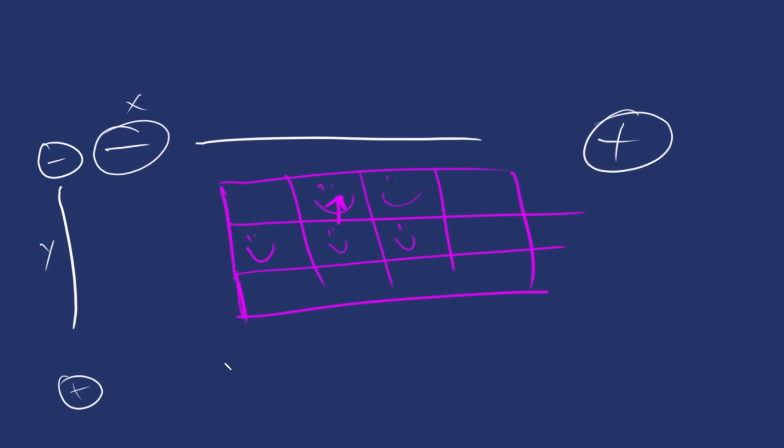Now, whenever these are picked up on the EKG, they're being picked up as a vector. Okay. So if we were to say that this guy went off with a force of 2, just for the sake of explaining this part, because when you get more in depth, it can make things kind of confusing. Let's say he had a force of 2 going this way. That's going to make a deflection, let's say, this big.